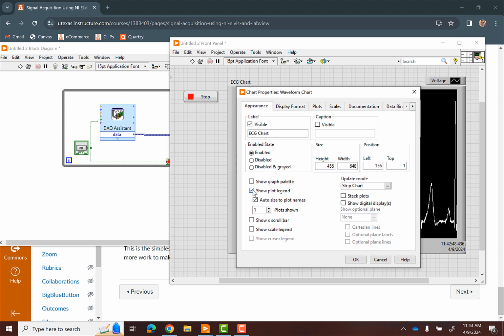Like ECG chart. There's show plot legend. The plot legend is this voltage. I don't know if we need to see that, so I'm going to remove that. You can go through and consider what some of these are. We're going to use a strip chart, but you can look at a scope chart and a sweep chart if you want. Maybe you prefer those other types of charts. That's fine. But I'm just going to use a strip chart because I think that looks best.